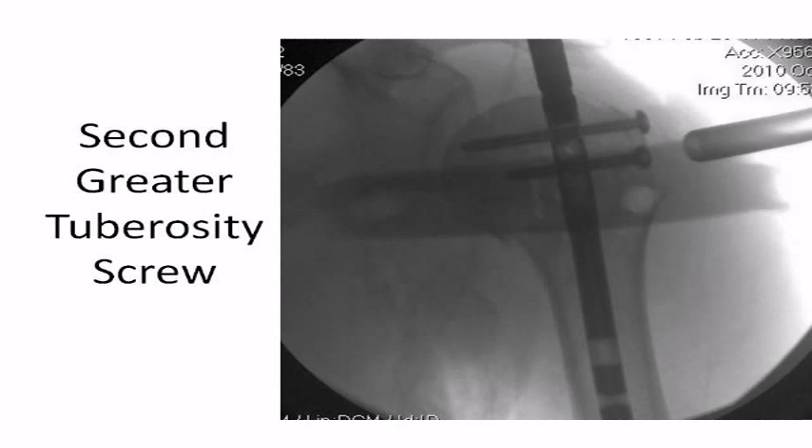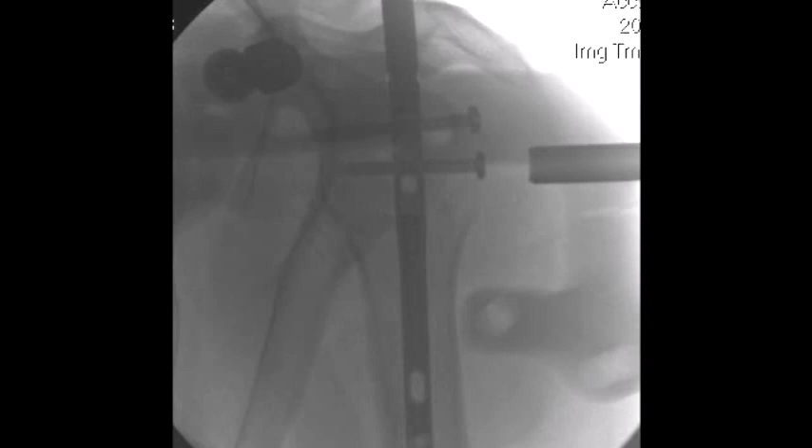The AP x-ray shows compression of the tuberosity to the head. The compression occurs because of the screw purchase into the polyethylene sleeve of the nail, which not only locks the screw to the nail, but also pulls the screw inward during rotation, compressing the screw head against the greater tuberosity.